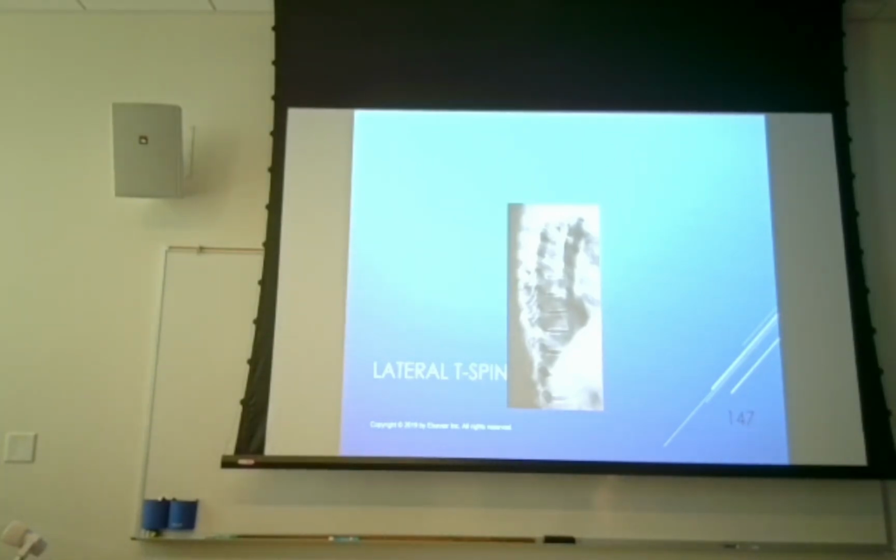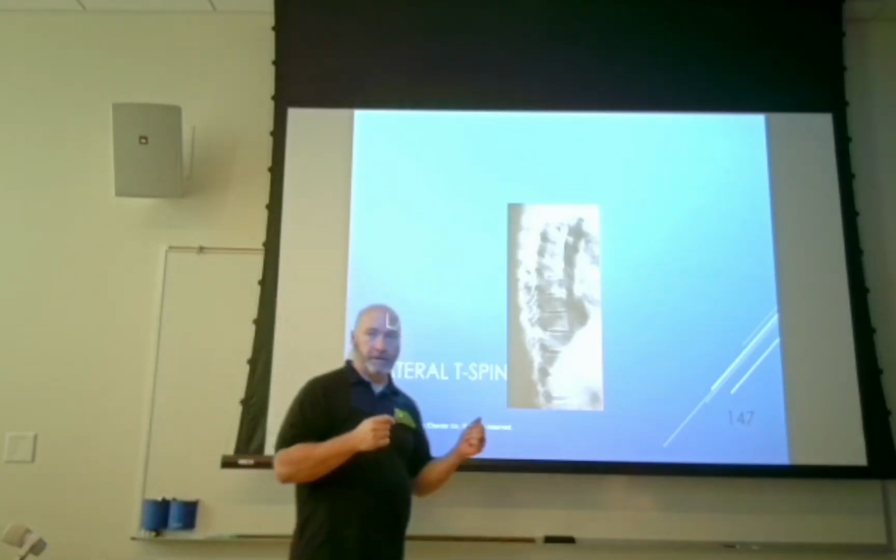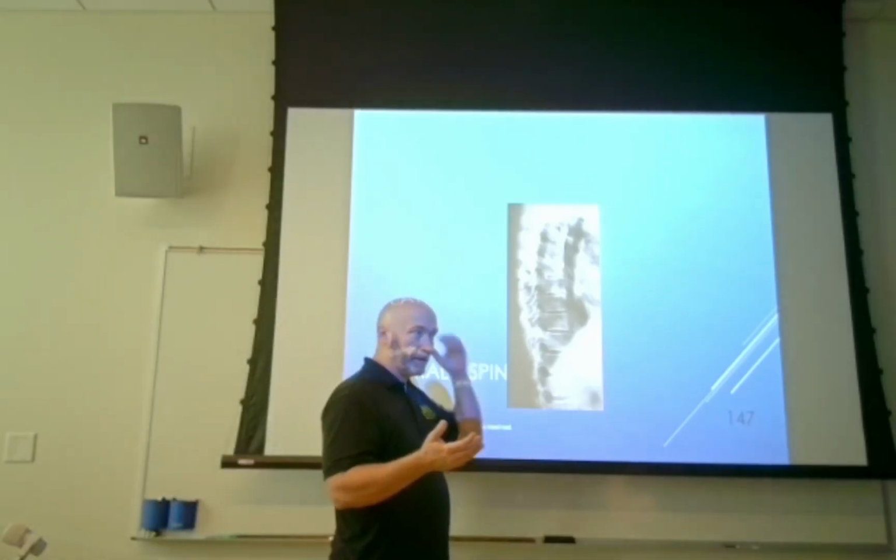So if you read through the description and you're looking for numbers, the middle of the middle paragraph or column says that we're going to use a 20 degree oblique, but that 20 degrees is from lateral. So it's really a 70-degree oblique.